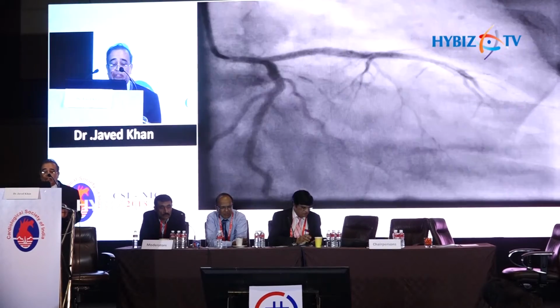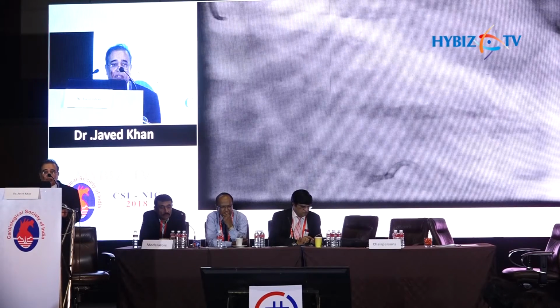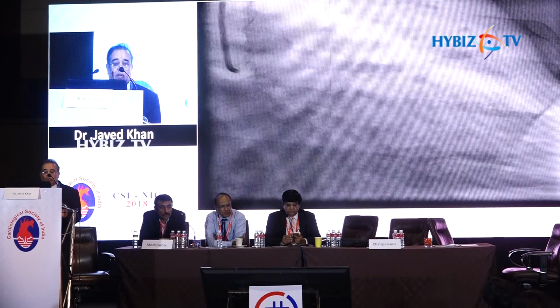The angiography was done immediately and you can see in this film the pigtail catheter is already in the pericardial sac. The contractility is already down. This is after aspiration of 250 cc of hemorrhagic fluid. So the patient had a lot of contractility problem, hypotension.